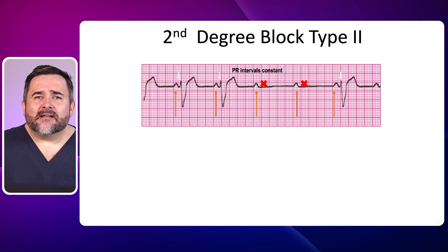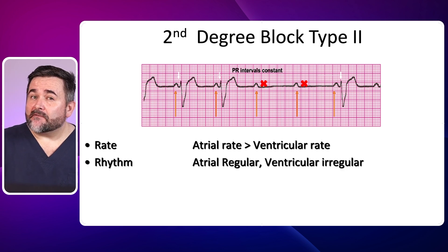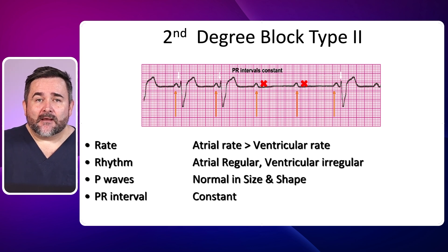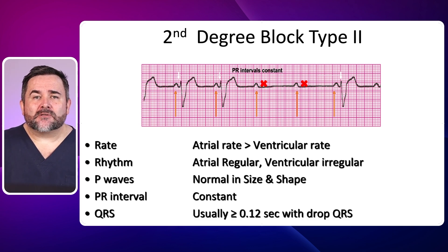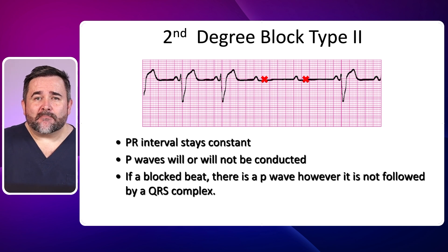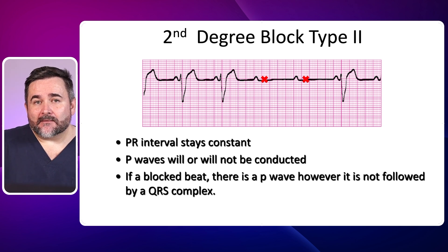Here we see a second degree block type 2. The atrial rate is more than the ventricular rate. The atrial rhythm is regular versus the ventricular rhythm which is irregular, as there are dropped beats. The P waves are normal in size and shape and you will find more P waves than QRS complexes. The PR interval is usually within normal limits but can be prolonged; however, it stays constant until there's a P wave without a QRS complex. The QRS is usually three small boxes or more with some dropped QRS complexes. The main concept to remember for second degree block type 2 is that the PR interval stays constant until you have a dropped QRS.